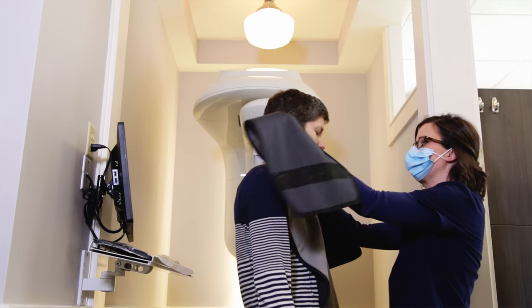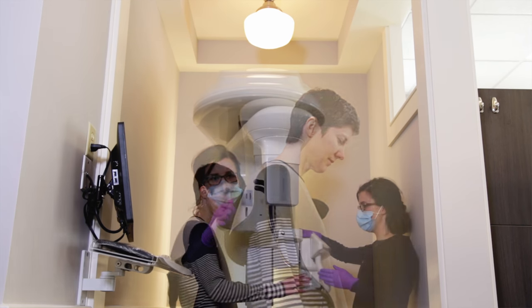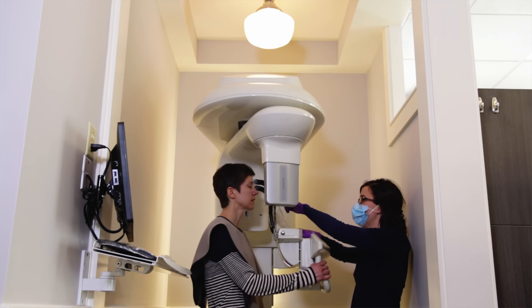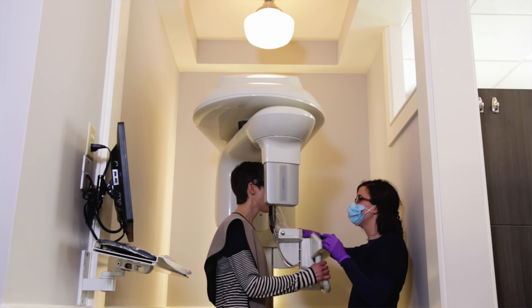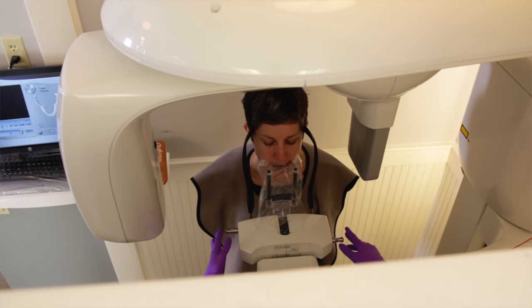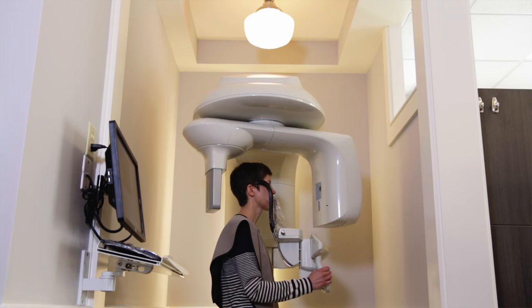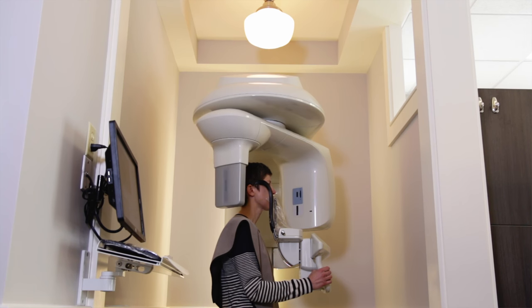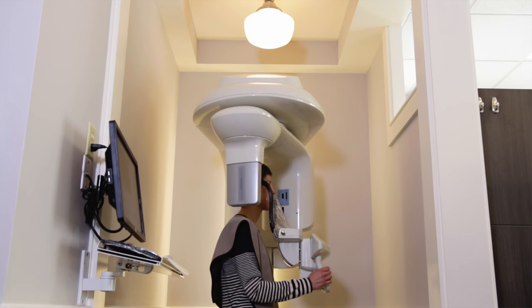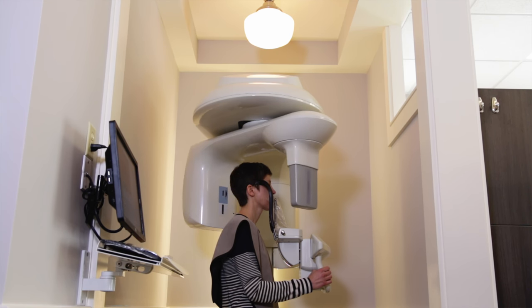Before the scan begins, patients are protected by a special apron that covers the torso, both front and back. Once the apron is placed, the patient is positioned in the scanner to accurately and precisely capture a 3D image of specific teeth and the surrounding structures. The scan only takes a few seconds — the patient just needs to stand or sit still. The scanner rotates once around the patient to capture a complete 3D image.